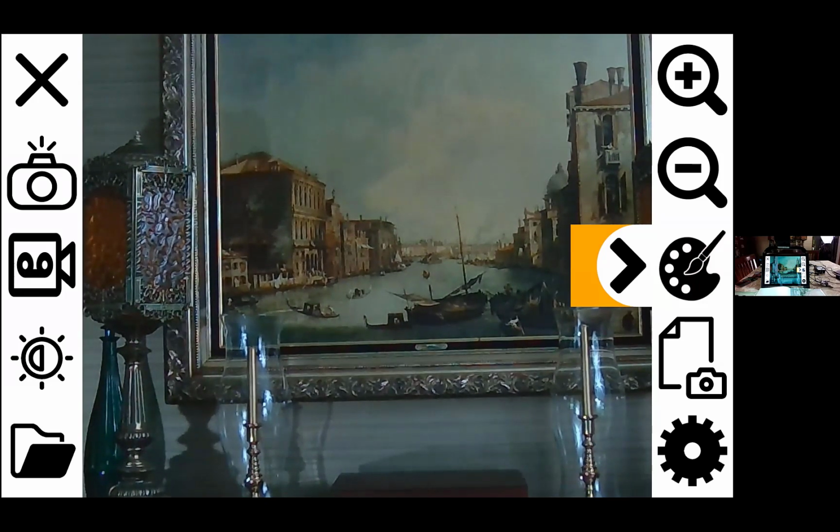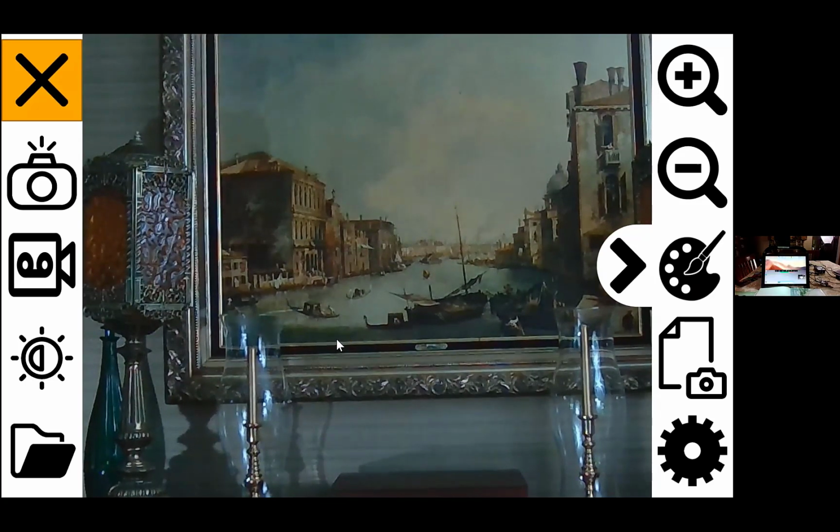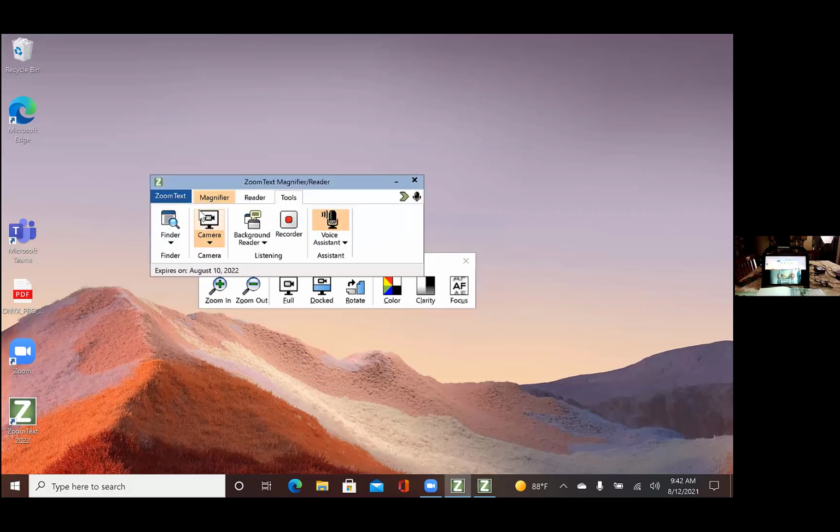Yep. And then when you come out of that full view, so you're done with the magnification that you need at that particular point, it will re-engage whatever settings you had in a full desktop view within Zoom text, within the Windows system. And so there we are again to our split screen with my desktop on the top using Zoom text. And you'll see Zoom text right there. And on the bottom is the distance camera, and you'll be able to see that's live because I'm going to switch back down to the text in the book. And there you go. So good stuff.